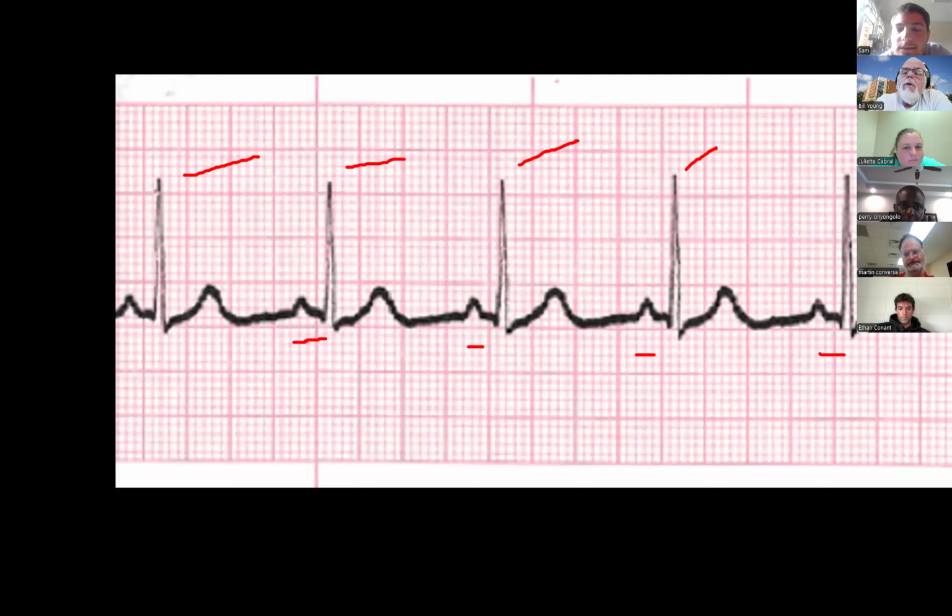Yes. What would you estimate, Sam, that the width of the PR interval is? Again, it's a little difficult to tell because when we project these, it's not always the best. So kind of like horseshoes and hand grenades, close will be fine. Looks like 3 little boxes.